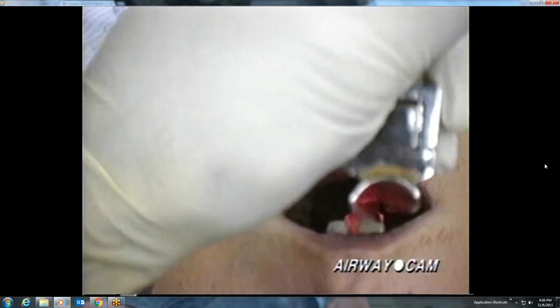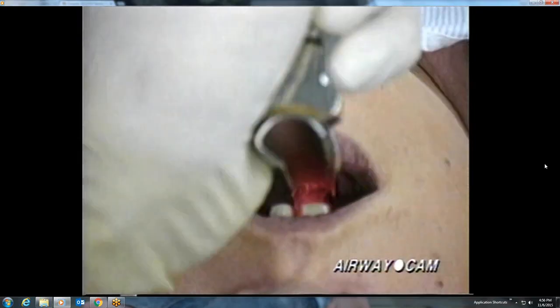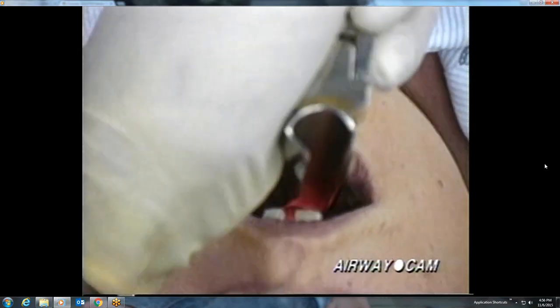The following two laryngoscopies show the importance of proper tongue control. The same blade is used on the same patient, but with much different results. In the first case, the epiglottis is readily located, and the initial view of the larynx is actually very good, including the posterior cartilages and the white of the true vocal cords. The epiglottis falls down repeatedly, however.